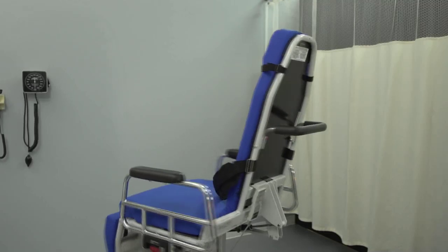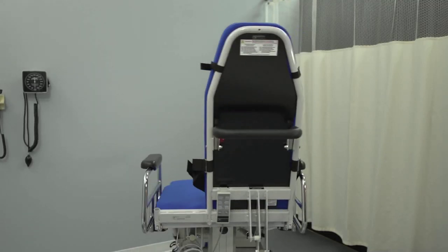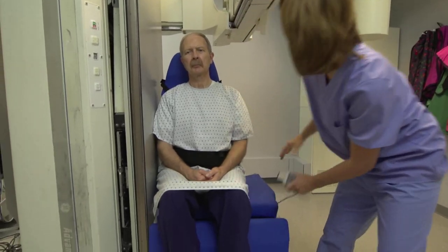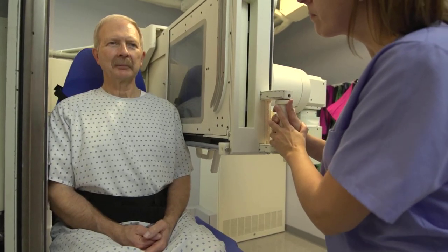Now let's get to why the TMM3 is the best choice for swallow studies. TransMotion Medical has designed this chair from the ground up for precisely that procedure. Its exceptional motorized positioning and unique structural design let you perform fluoroscopy tests accurately, safely, and more efficiently than ever before. The chair has a narrow back section with a large radiolucent window, and it fits comfortably into any RF tower so you can perform x-ray and fluoroscopic procedures without moving the patient from the chair.